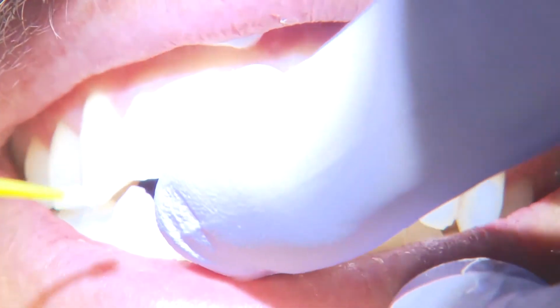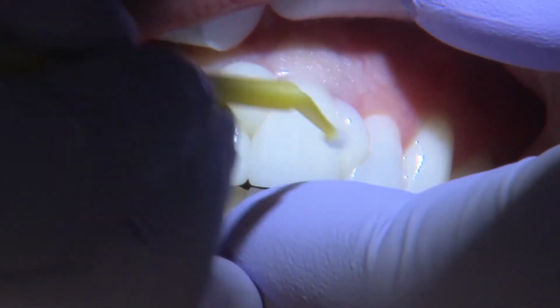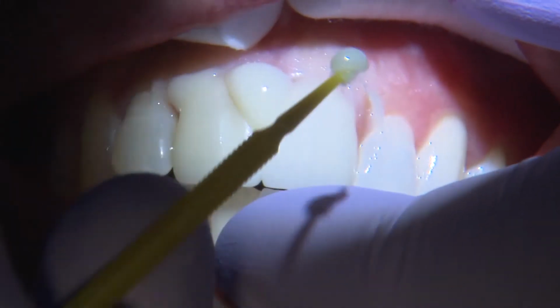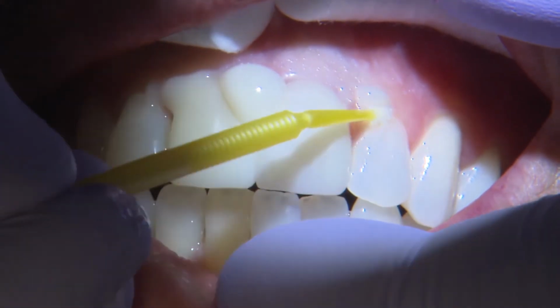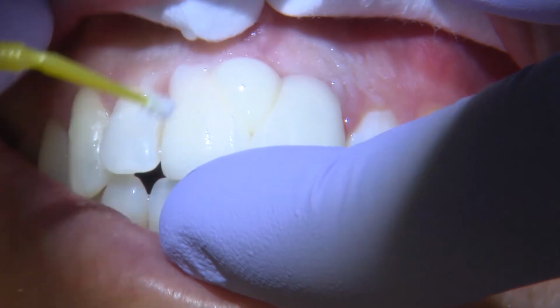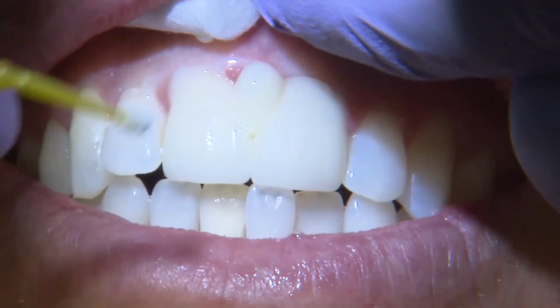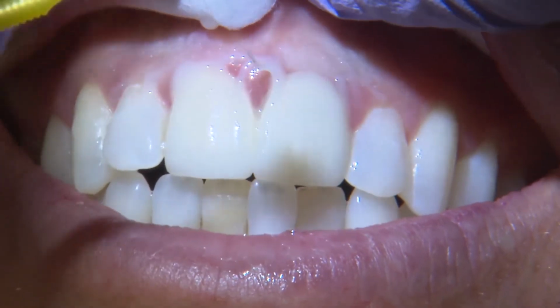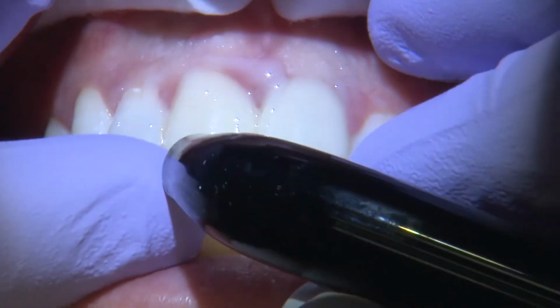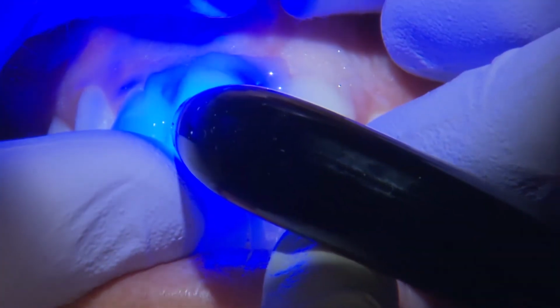the BioTemps. So in this situation, I'm actually using Tough Temp for the reline, and once the temporary material is placed inside the BioTemps and I'll seat it on top of the restorations, I can sometimes remove a little bit of excess material so that my trimming and polishing time will be reduced. Obviously, you want to take care to not wipe off some of the excess from the margins so that you can capture the margins properly.